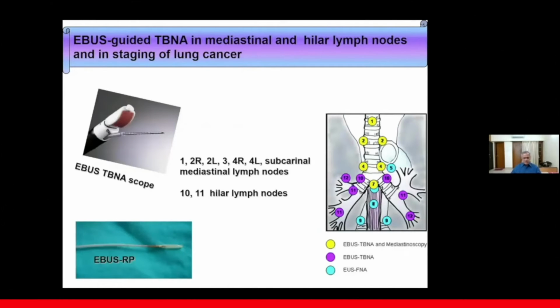which means bacteriological pathology. By that I mean the AFB smear, AFB cultures, Gram stain cultures and the TB cultures. You can take a sample for GeneXpert, check for the AFB culture, and also rarely we have picked up Pseudomonas and similar organisms from the aspirates of these lymph nodes. We have picked up viral lymph nodes. For staging malignancy, also, you can send and get the stage. And if you're lucky, you can also take a good core material.